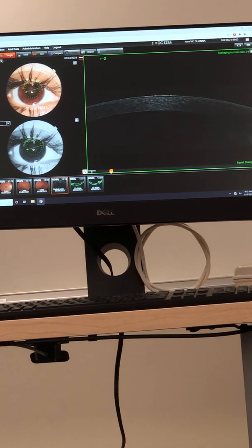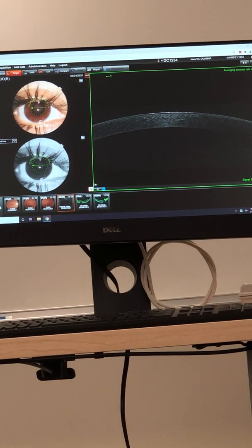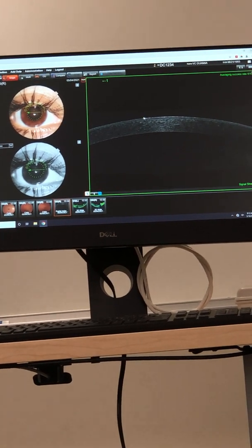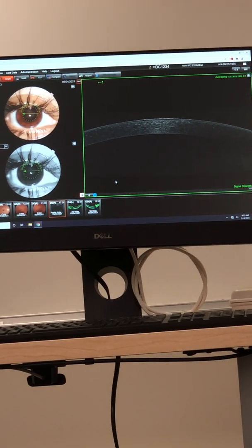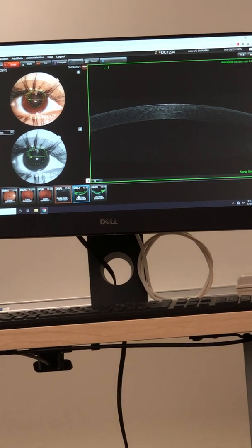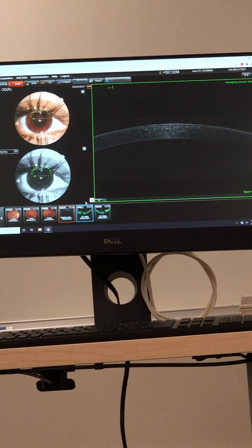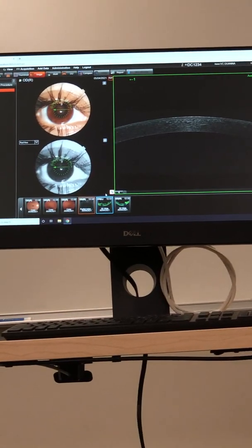Can you go over what it is that we're looking at with this radial scan? This is the cross-section of the cornea? Yes, that's exactly what it is. We were playing around with this a couple of weeks ago after training. Is there a pachymetry now?